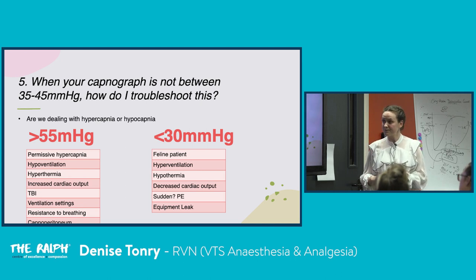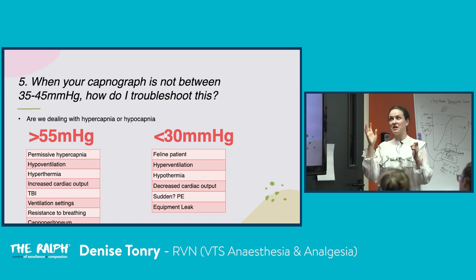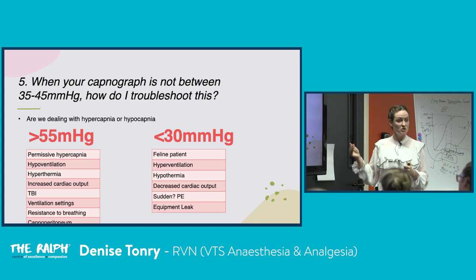Increased cardiac output. So you may have had a patient that was hypotensive, and you'll see a few videos of us treating low blood pressure, and the end tidal does increase. So it increases with blood pressure. Naturally, you're getting more blood to the lungs and you're shipping off more of that CO2. So sometimes it's not something we tend to treat, because it's generally something we had hypotensive, low end tidal. We treat the blood pressure, we get a slightly higher end tidal and we're quite happy, to be honest. It never goes up to 60 or 70, but sometimes, if you weren't ventilating them appropriately, you can see a massive 60 millimetres of mercury and think, where did that come from? But it could be that you've just bumped up the cardiac output.